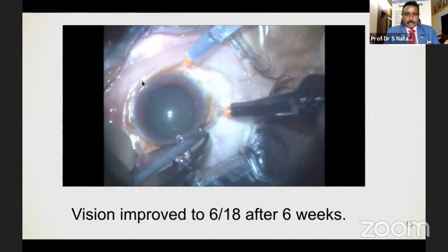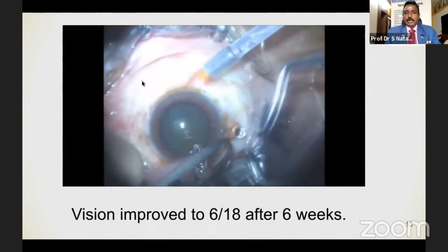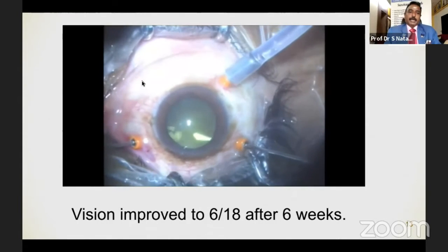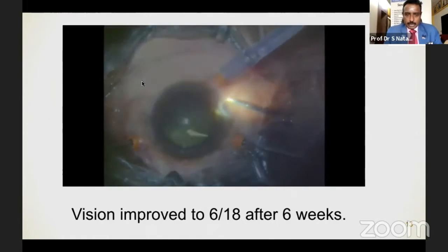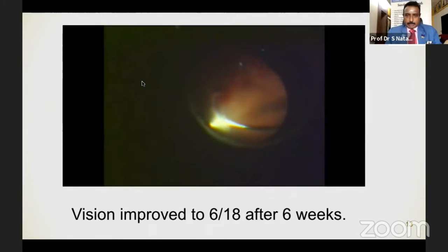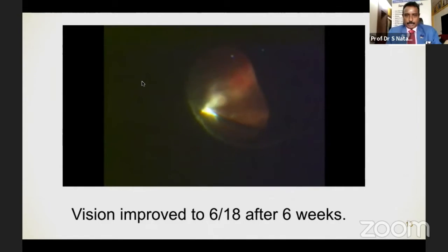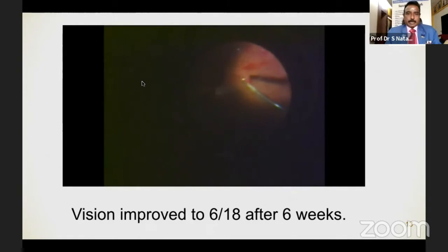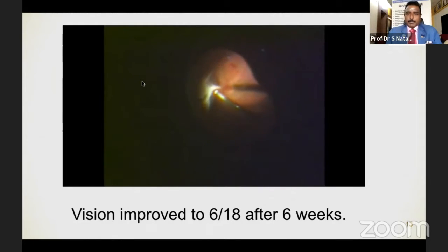You can see the phakic eye, and usually I don't like to do a combined procedure at that stage because in a diabetic eye, the lens still acts to prevent the posterior vascular growth factors from migrating to the anterior segment. So if you have the lens in position and then do the vitrectomy, and in case the cataract becomes more dense, you can plan for a cataract with IOL. In some eyes, you use silicone oil, where it can be combined with silicone oil removal.